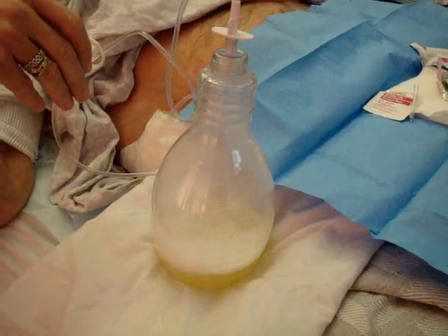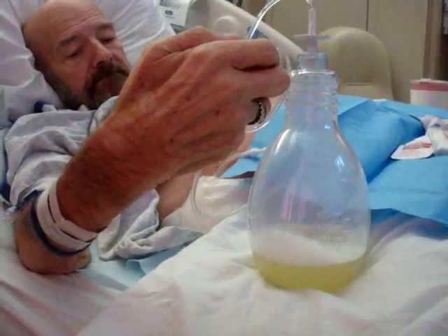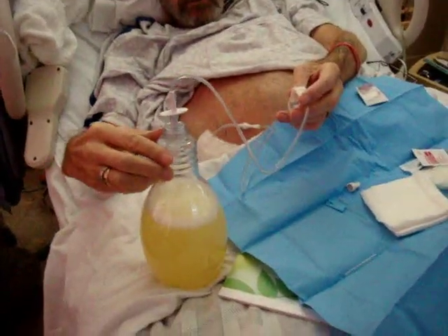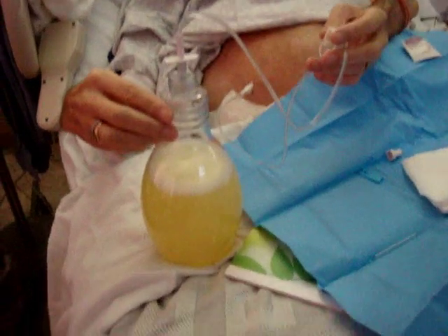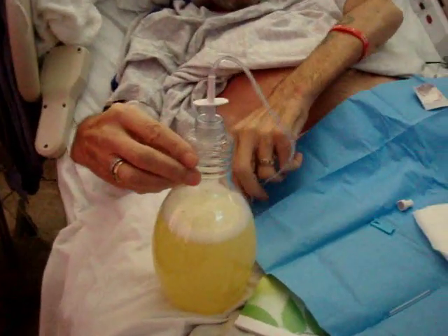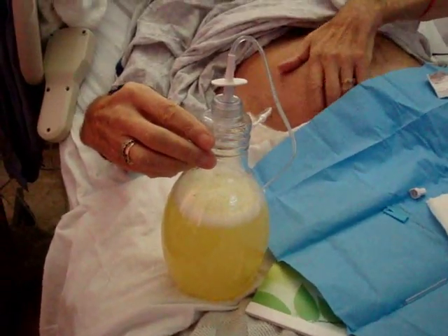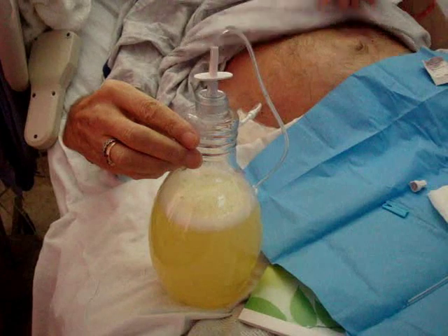My wife's doing a wonderful job. You can see the level rising slowly. It hasn't filled the bottle up quite so much this time. I've had to do a bit of wriggling around and turning a little bit on my side, and massaging my tummy — it all seems to make it go through. Maybe there's not so much fluid in my tummy. Maybe there just wasn't as much fluid as there was yesterday, which would be a good thing.